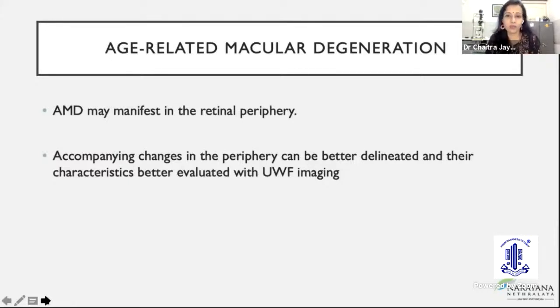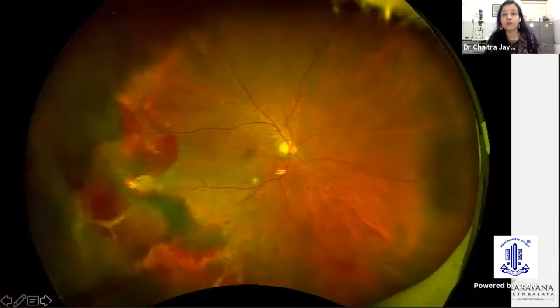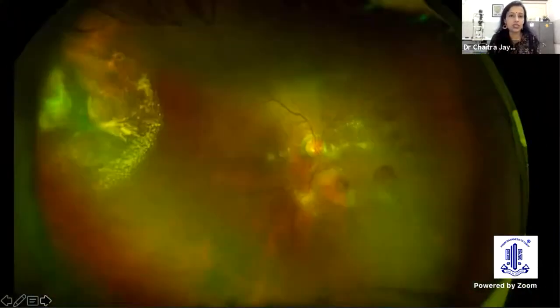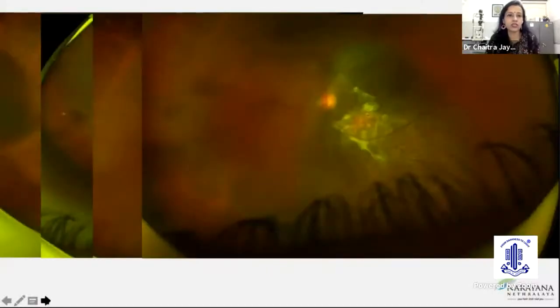Why would you need the periphery to be seen? Why documented? Now, this is a patient who had a peripheral PCV that we all now are aware of. And post prior therapy, you can see good regression of the disease. This is a patient whom, if you saw the posterior pole, you would just think it's diabetic retinopathy with macular edema. But then again, had a peripheral PCV-like lesion, which again underwent treatment, a middle-aged lady.